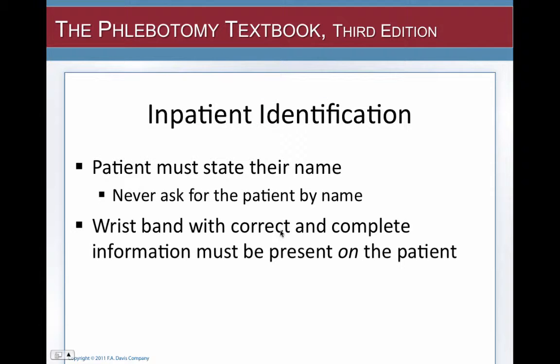For inpatient identification, the patient should or must state their name. Never ask for the patient by name, meaning don't walk in and say, Mrs. Jones, with an open-ended question, because if they are not lucid, they may say yes. They may not be with it. They may think they are Mrs. Jones. So you always ask them to state their name. You don't give their name to them.